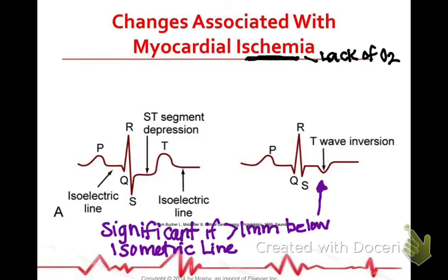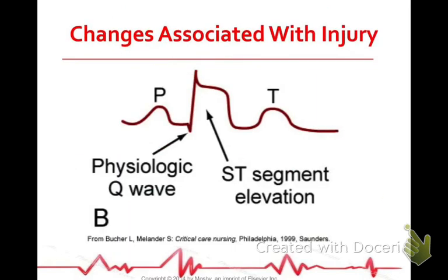So you've got your lack of O2. This person, this rhythm's going to go straight to the cath lab, isn't it? This is ST elevation. You've got your QRS. Your ST is elevated. Your T looks kind of normal, but your S to T is elevated.